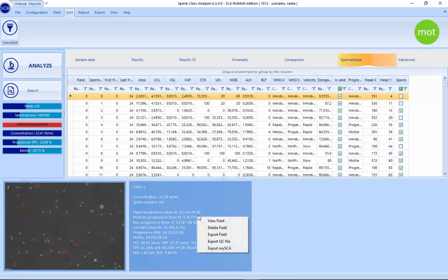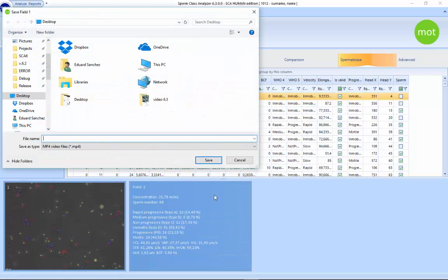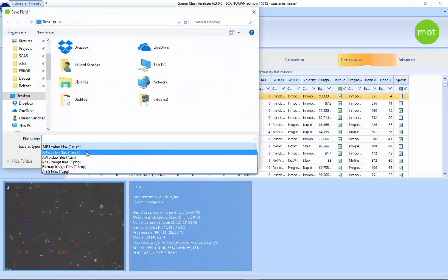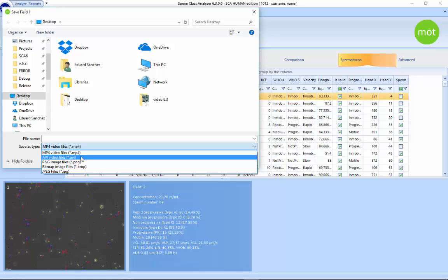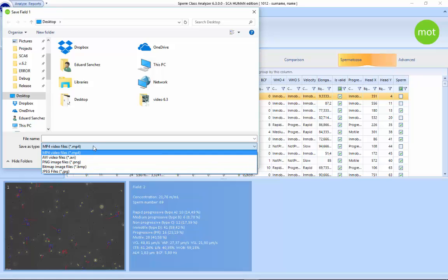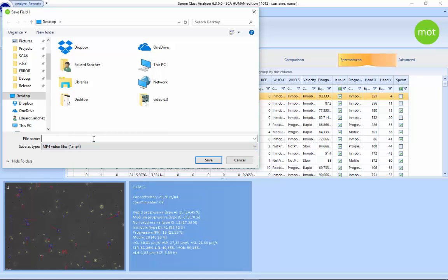Also in version 6.3, we have the export field feature with different format options: MP4, AVI, PNG, and BMP. When you export, you can choose to export with the tracks or without the tracks, so you can select how you want to export all the different fields.